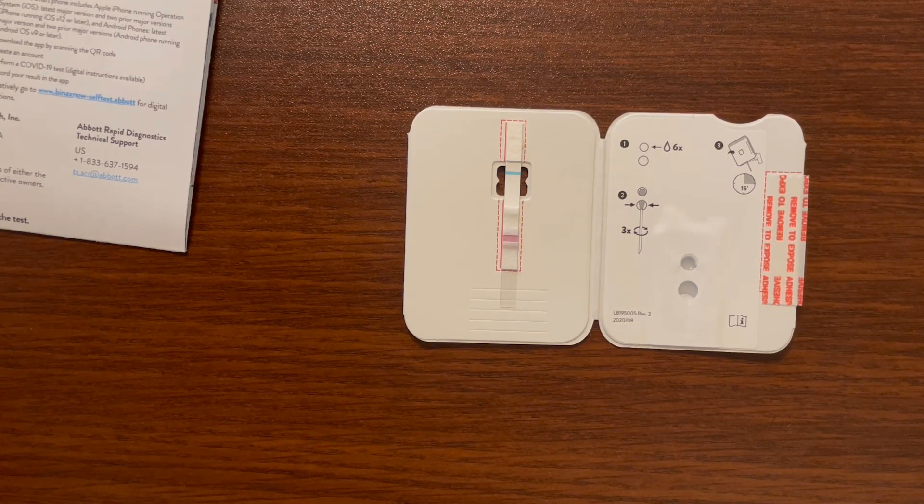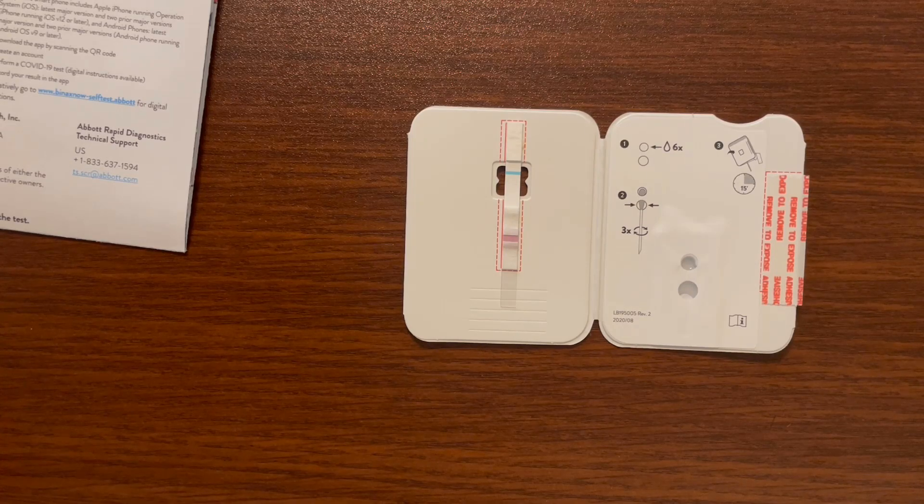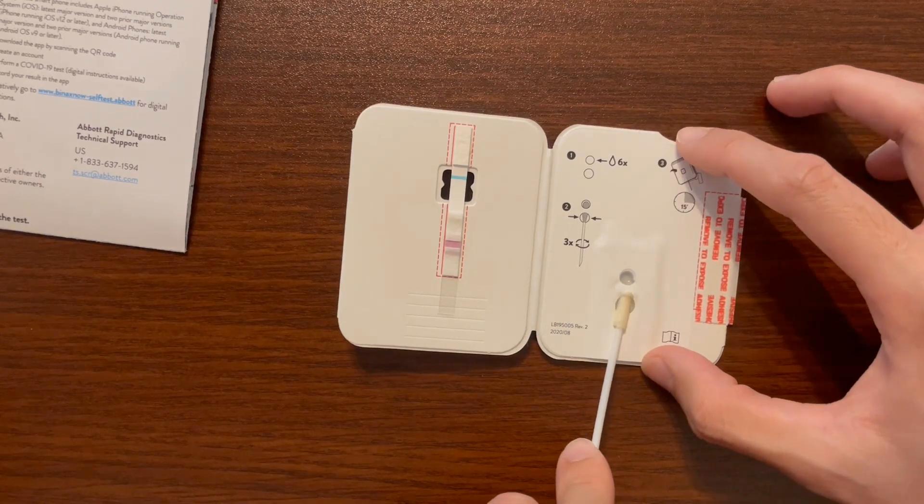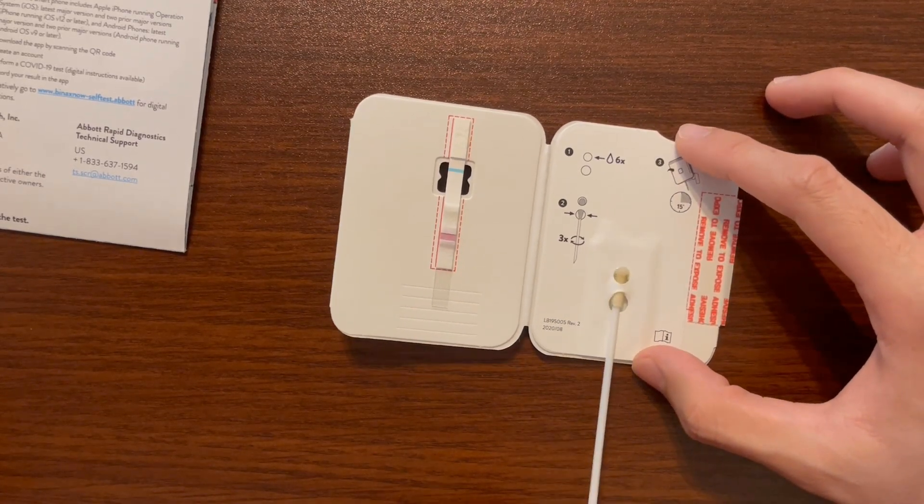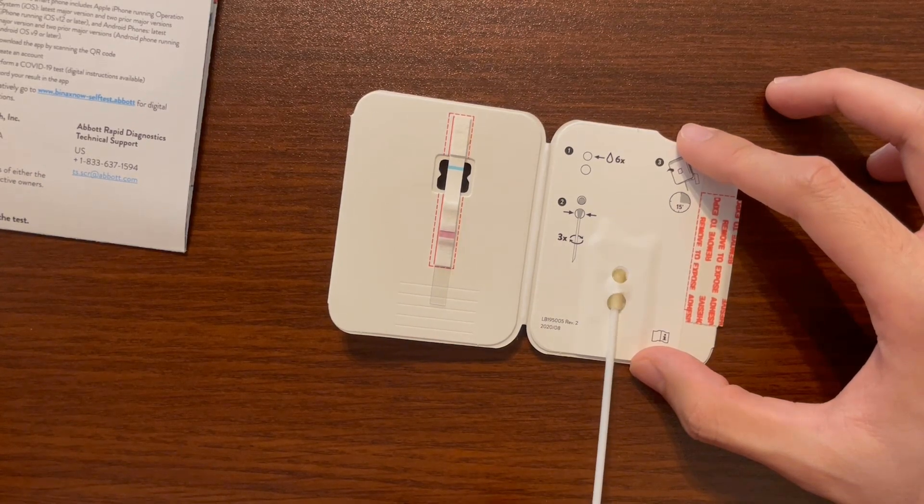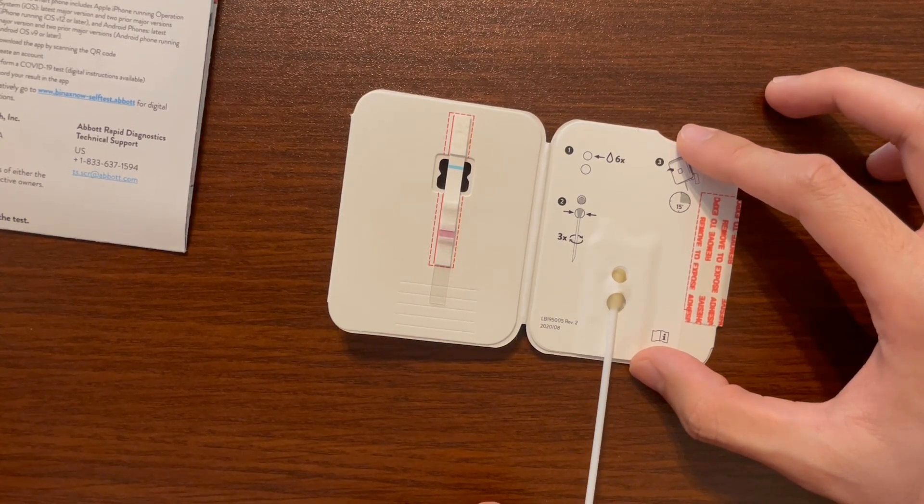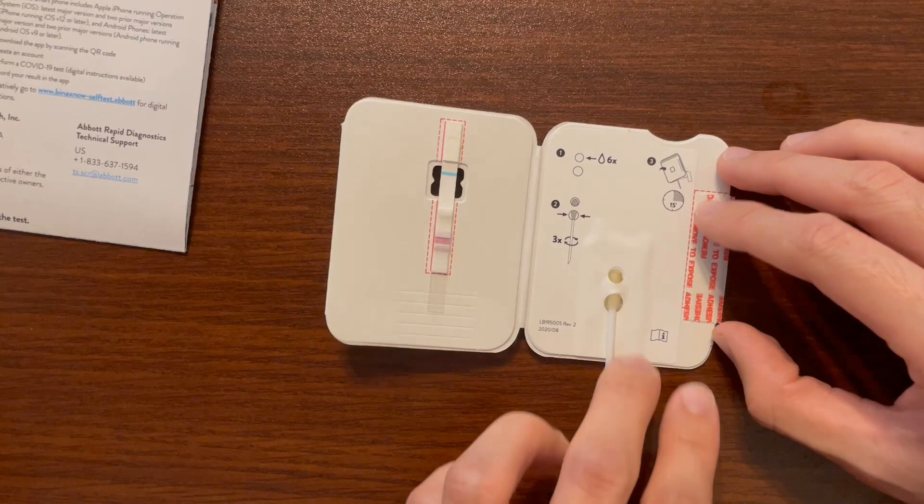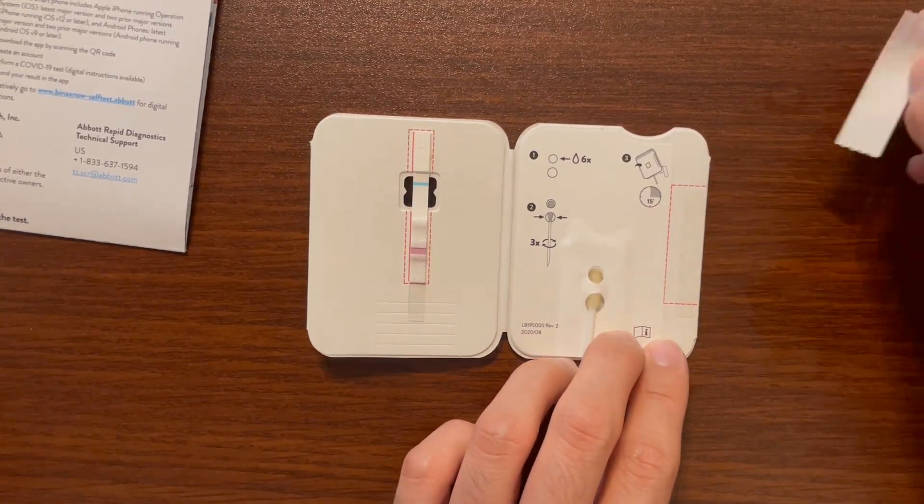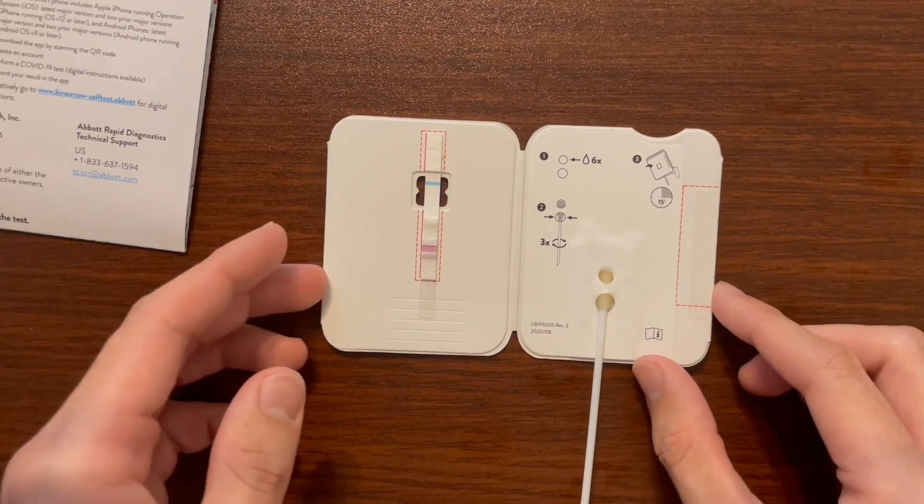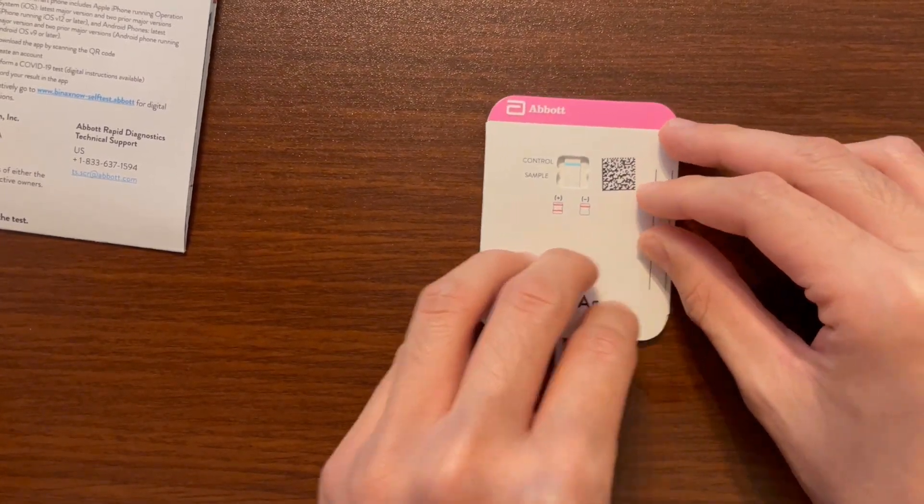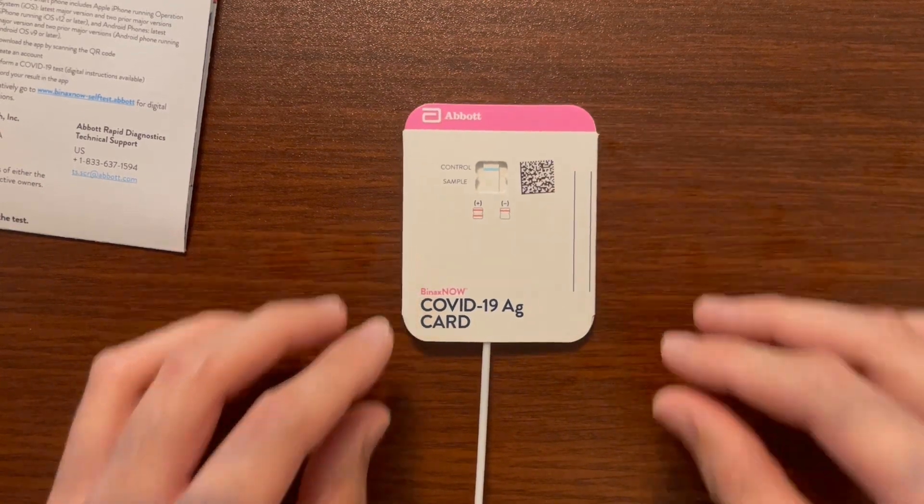Once you've done that, take the swab and insert it through the bottom hole on the test card. We're going to turn it to the right three times, so three full rotations. Keeping the swab there, remove this adhesive peel and seal the test card, making sure to press it down. That should be it.